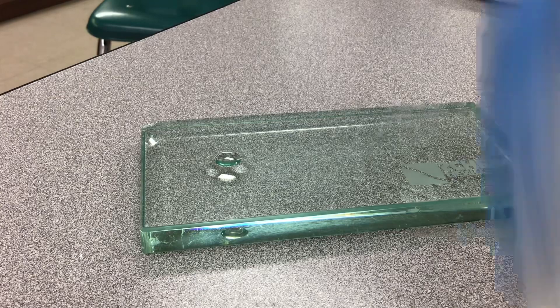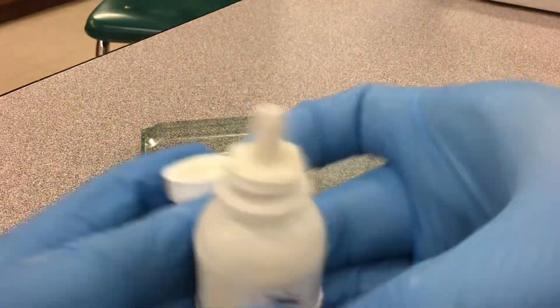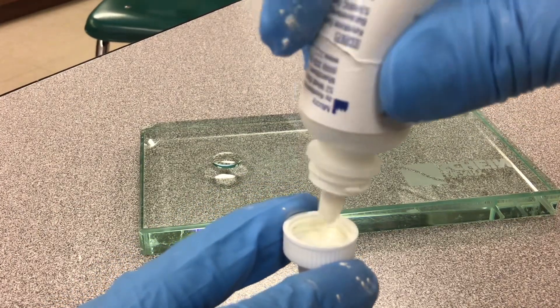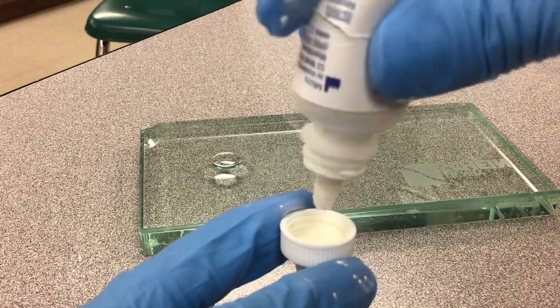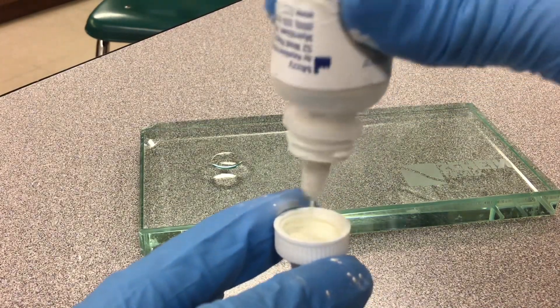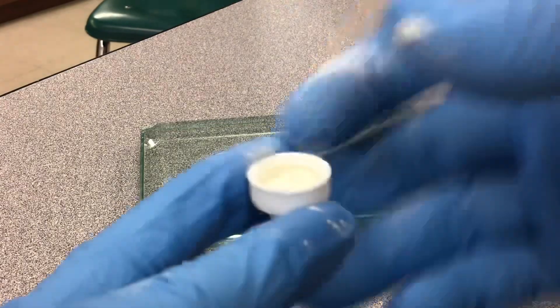And then you're going to get the powder, fluff it up, and then what you're going to do is put the powder into the container. So watch me real quick — this is going to be something you're going to be doing. Then you're going to pour it over here like this.